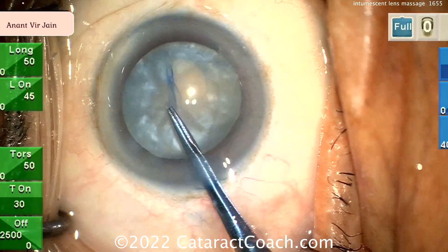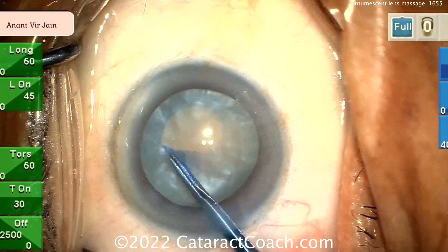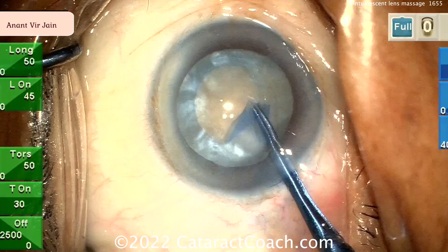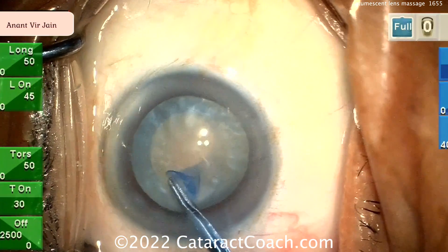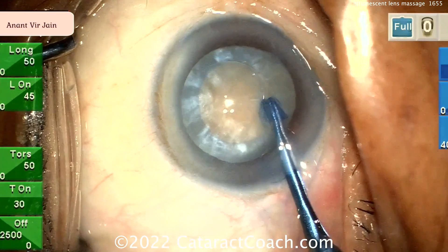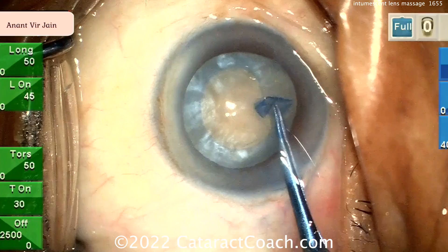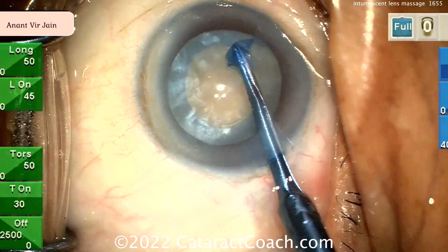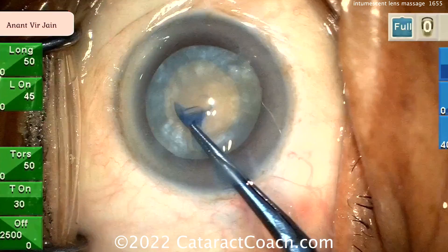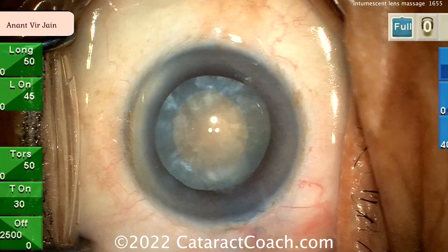Now let's take a look at getting this rexus done. We'll show three different cases today and go through all of them. Here it looks pretty good. In this case, fortunately, after a nice massage, there's really not a lot of lens milk coming out — very little lens milk being expressed. So maybe this was an easier one. Beautiful rexus there — very nice. The rest of the case is the same.